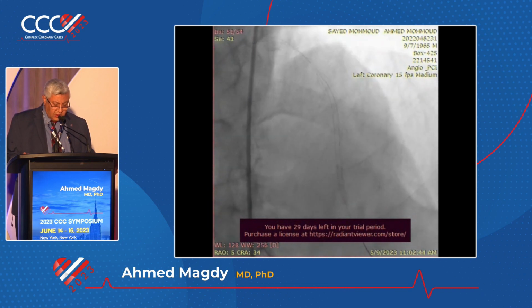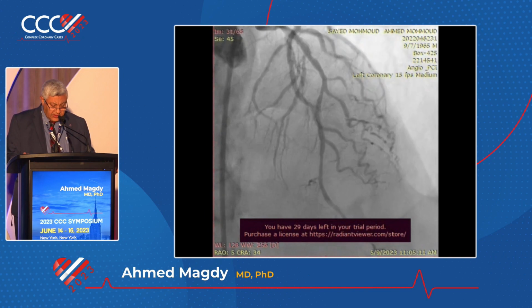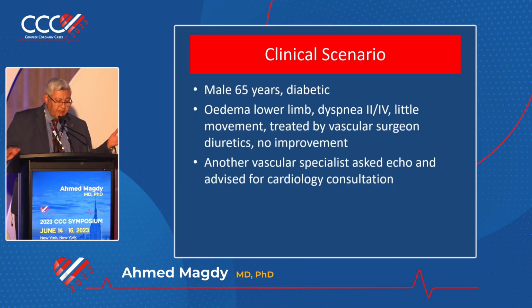Of course, it takes 40 to 45 seconds to inflate. This is the final picture.